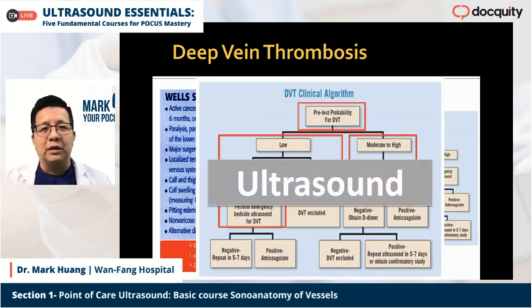So actually, if you understand how to perform the ultrasound, you almost don't need the D-dimer to prolong your diagnosis process, because if you have the ultrasound ability to scan it, it's over. You can do very quick and effective scanning.